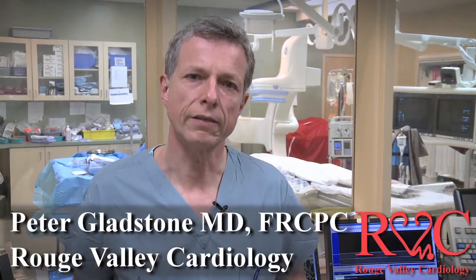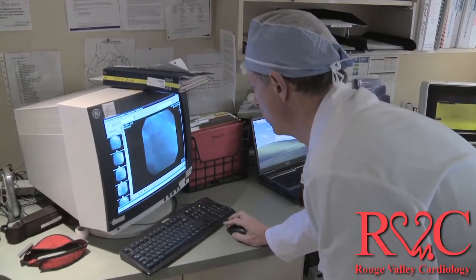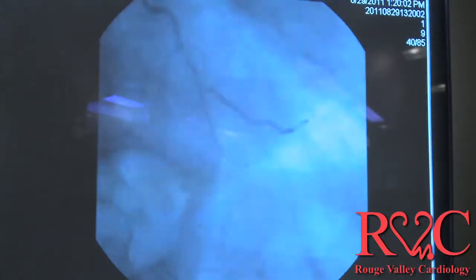Hello. The purpose of this video is to talk about the invasive cardiac tests as opposed to the non-invasive tests, which include echocardiography and exercise testing. We're going to talk now about coronary angiography and coronary angioplasty. Coronary angiography is where you take pictures of the coronary arteries to find out where the blockages are, and coronary angioplasty is when you actually fix them.